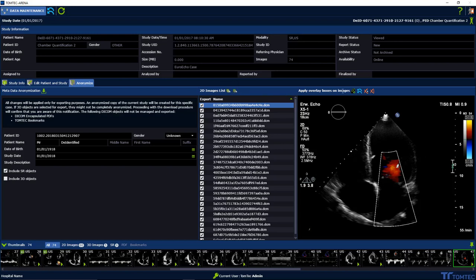On the right side, you can apply overlay boxes on images to cover information on the images.